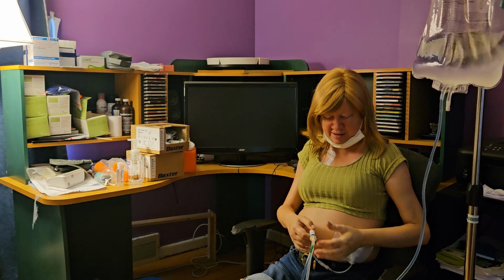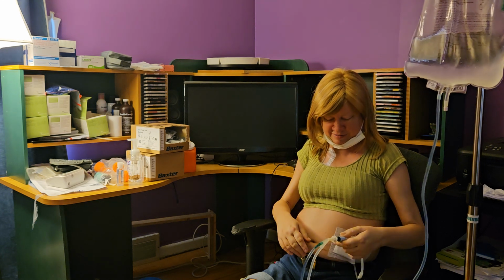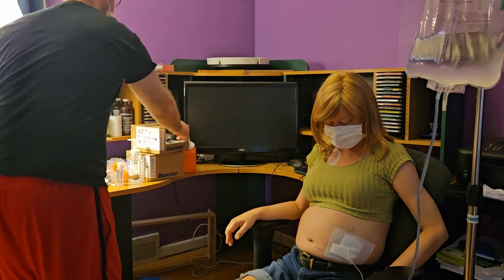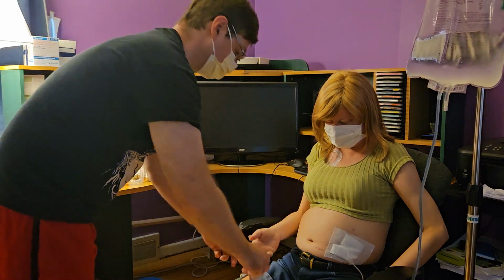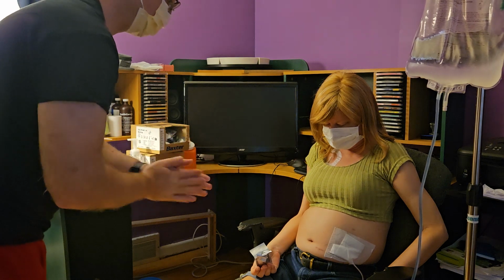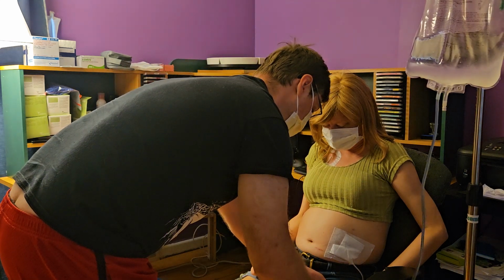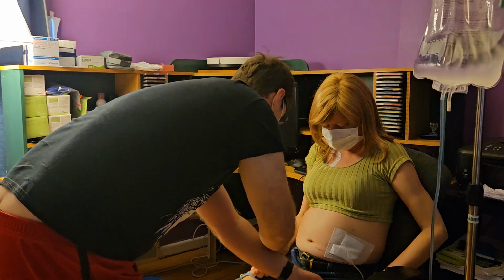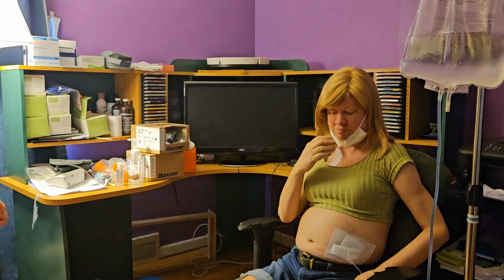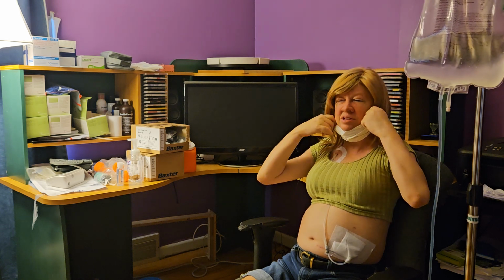There's not much left, so I'm just going to close this so it keeps me from contaminating. I close the roller clamp and then nothing goes in the line. And then it's done, I guess. And then you have to do this again in 4 more hours.